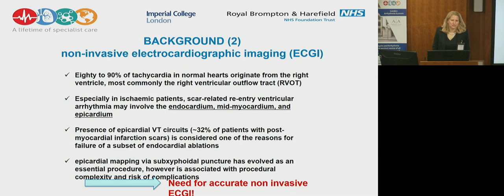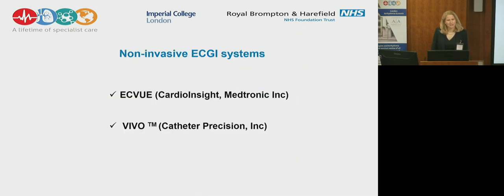Now, there are patient groups that have a higher chance for that. Pierre just told us about ARVCs. They're probably quite elegant to know and couple that to the fantastic FDG imaging that you've shown us. But again, it would be great to put it all together. Now, we do this, you could argue, from a 12-lead ECG of the documented arrhythmia all the time. That's what we do in clinic, right? We try to put this in our heads together with the anatomy of the patient and try to find where it is. But there are actually systems that help you with that.